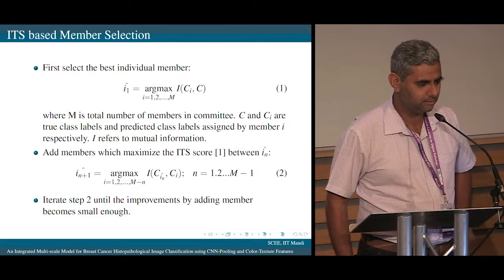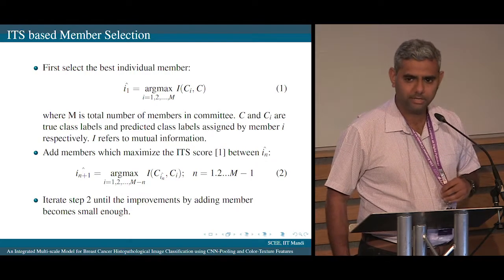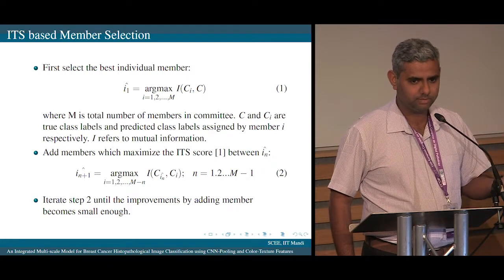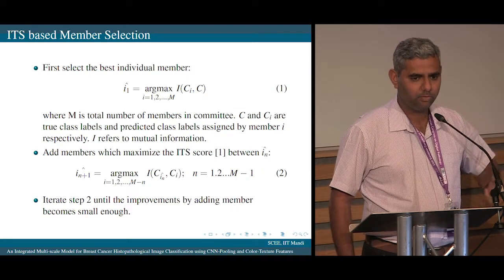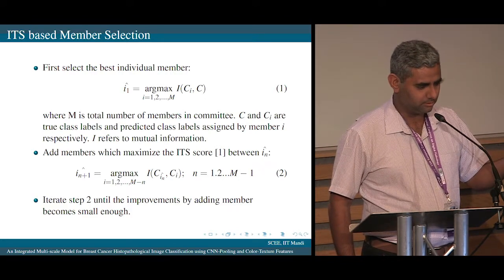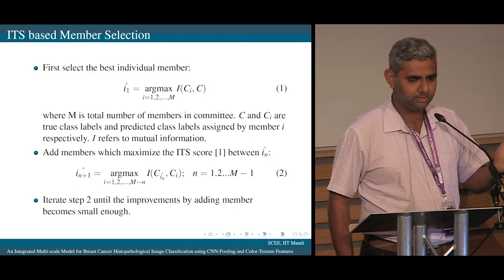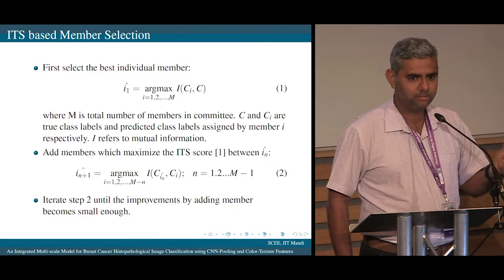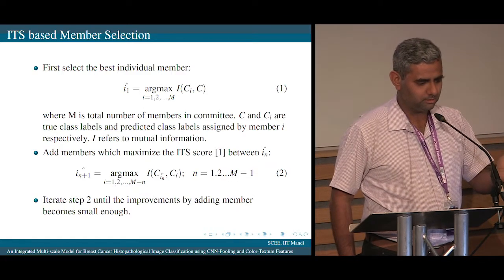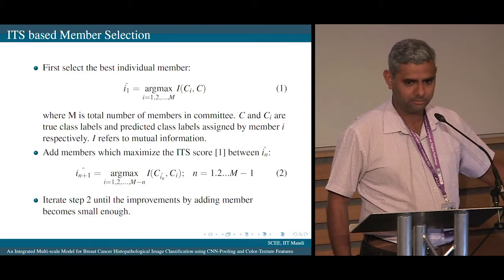this is essentially a work from 2010. We're borrowing the method from that work, and the idea is that we iteratively, in a greedy fashion, add the features which maximize the mutual information between the class labels and the best set up to the previous iteration, and the next set of features is chosen to maximize the mutual information between the classification accuracy of the currently chosen features and the classification accuracy till now.